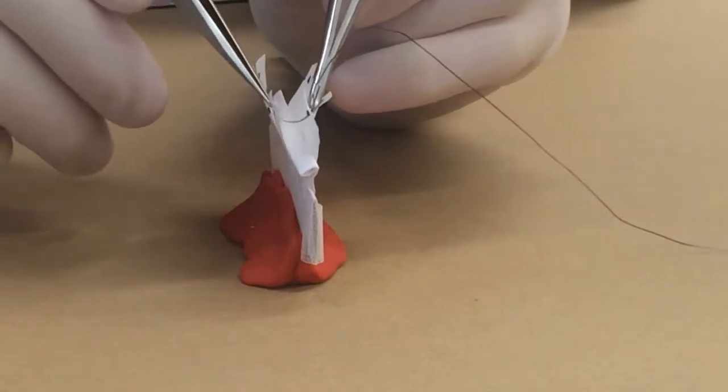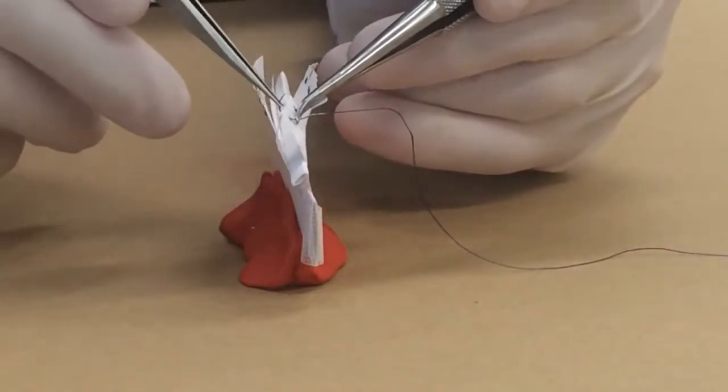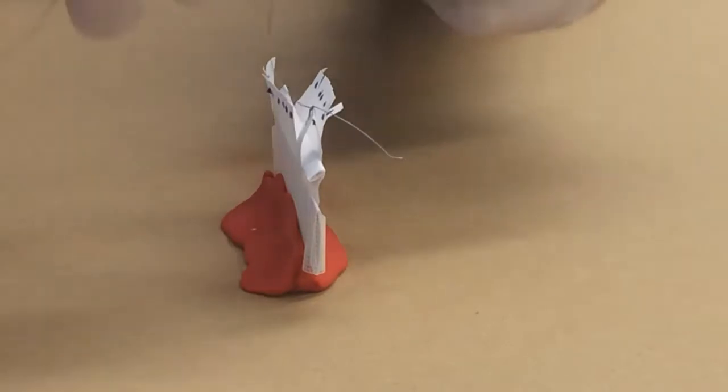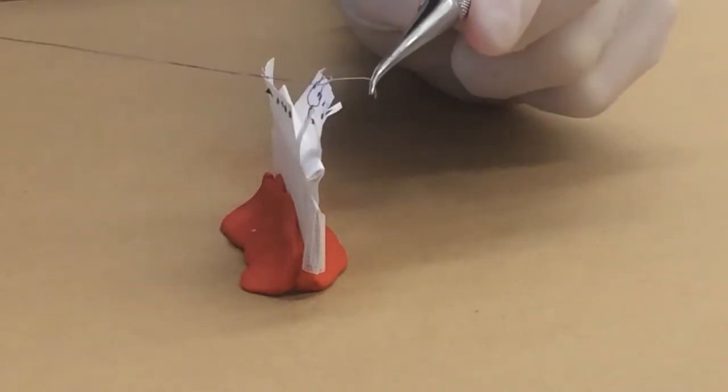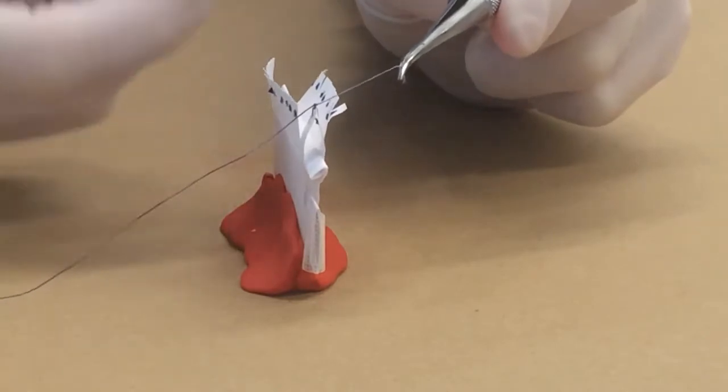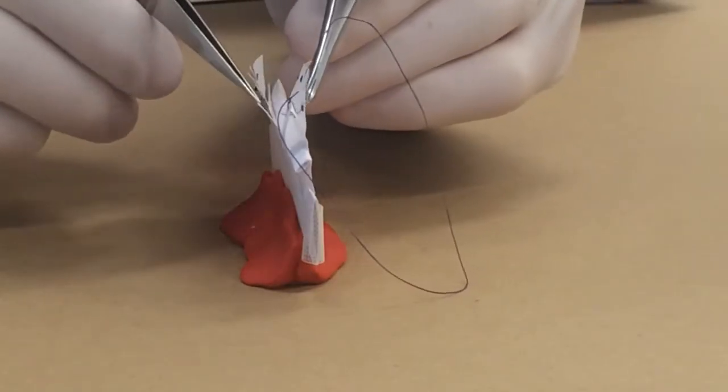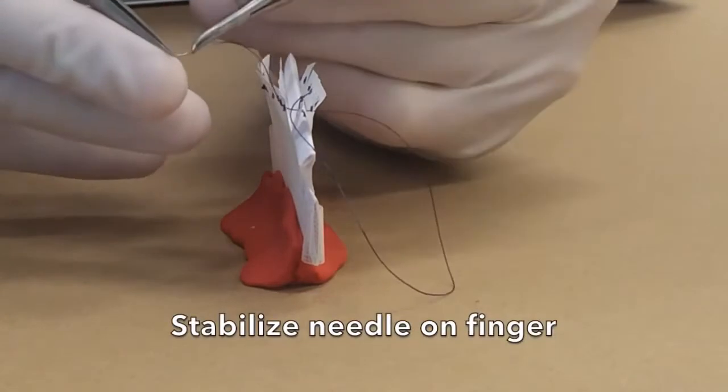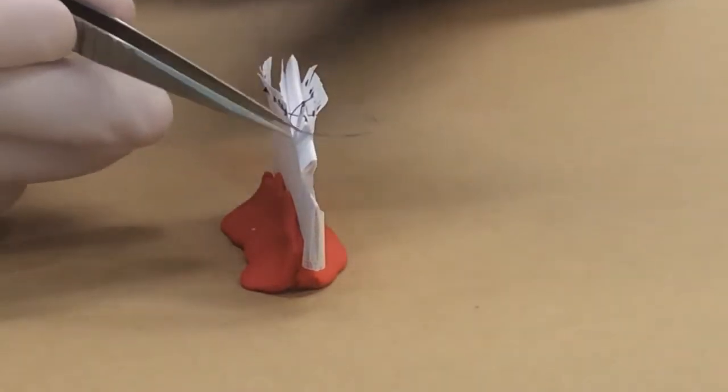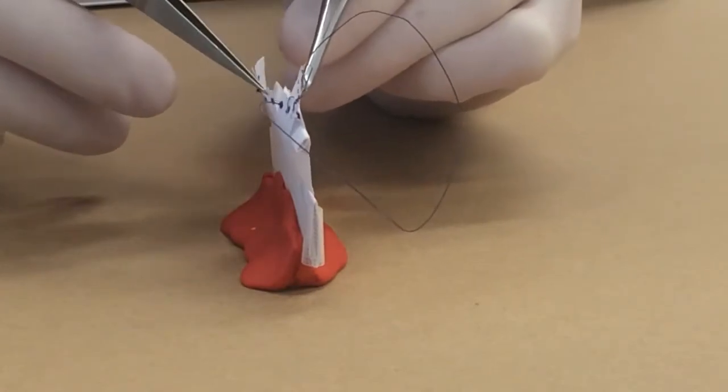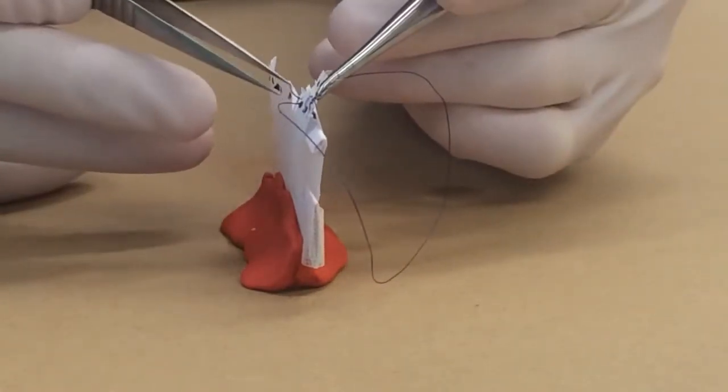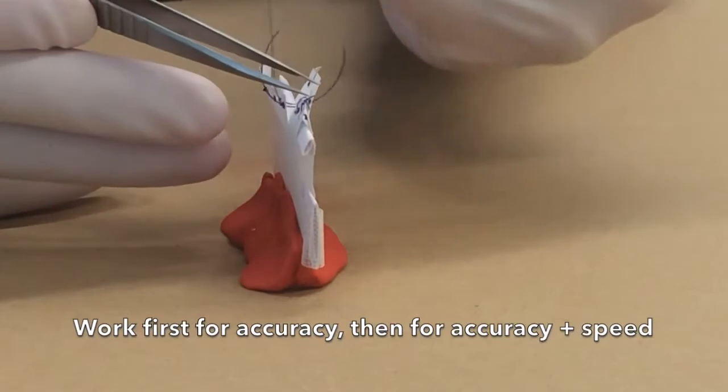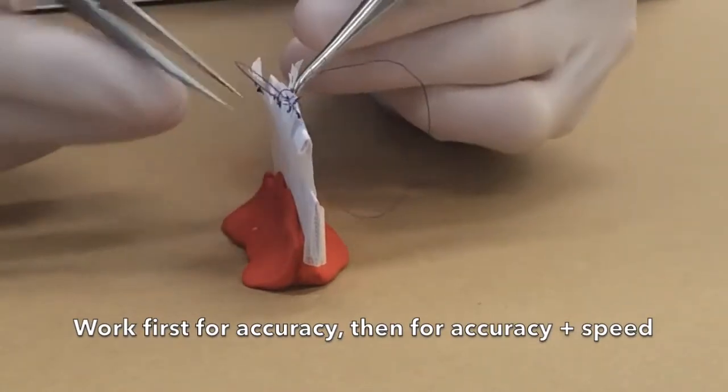The objective is to pass the needle through the prescribed target holes in the paper model using the forceps to move the edges of the paper to help coordinate proper needle placement. Stabilize the needle on a finger during needle reloading. It is important to work first for accuracy and then for accuracy plus speed.